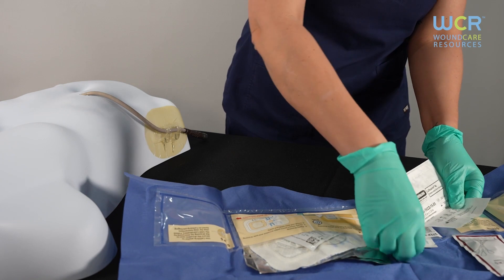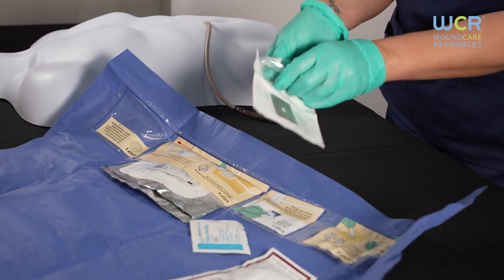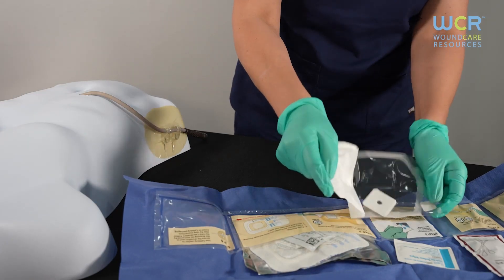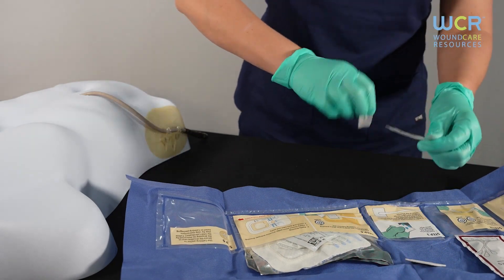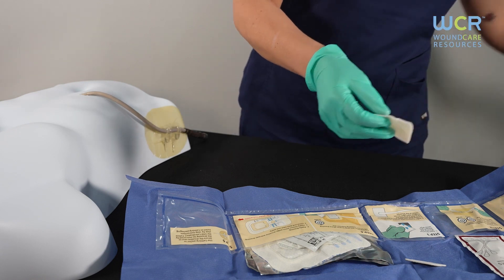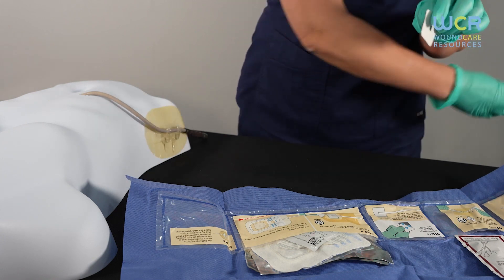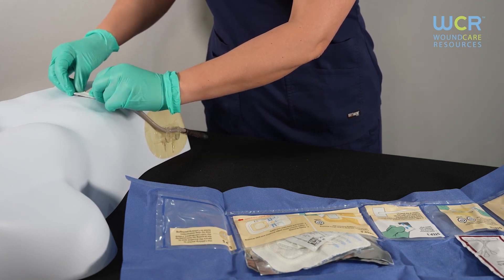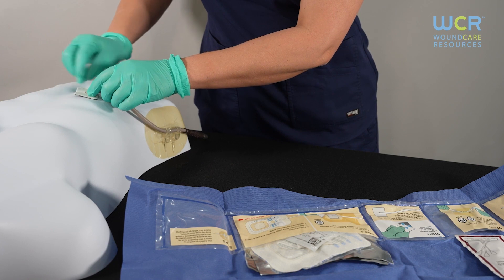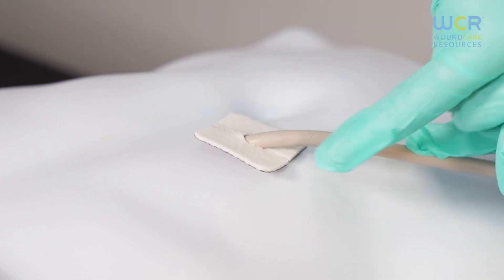Step 3 contains the Silverlawn disc and saline wipe. For immediate activation of the Silverlawn disc, dampen the dark silver side of the disc with the provided saline wipe. Avoid oversaturating the dressing. Place the Silverlawn dressing around the driveline exit site with the dark silver side down against the patient's skin. The slit should approximately align underneath the driveline to ease removal without pulling on the driveline.